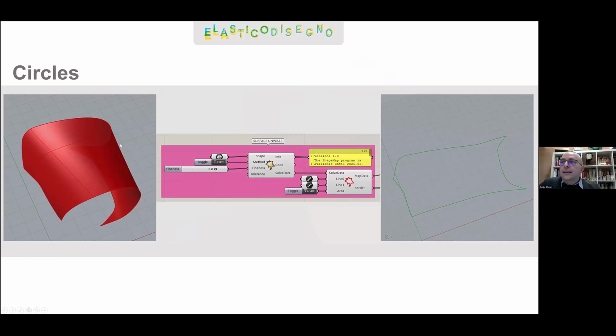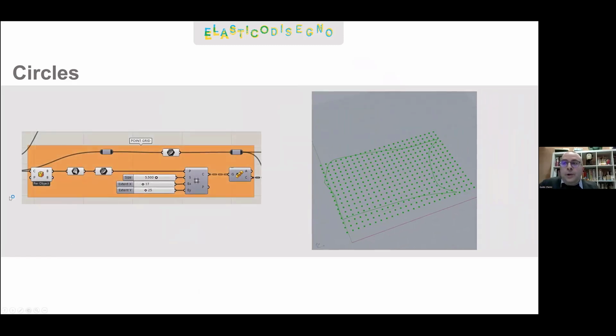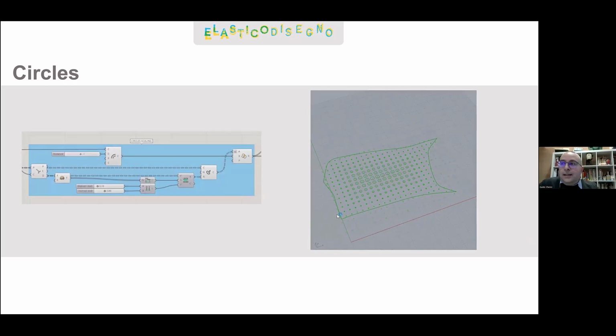first we created a simplified version of the cover surface of the area where we wanted to apply this texture, and we used the Shape Map plugin to unwrap the surface and obtain the outline. Then we created a point grid over this outline. We used a bounding box to generate a frame within which to create this point grid, so that the point grid didn't exceed the size of the actual surface. And then we applied circles on this point grid.